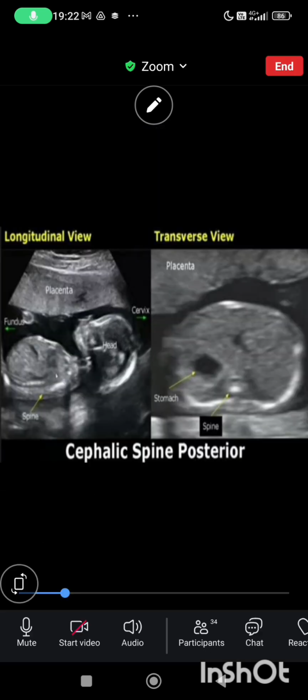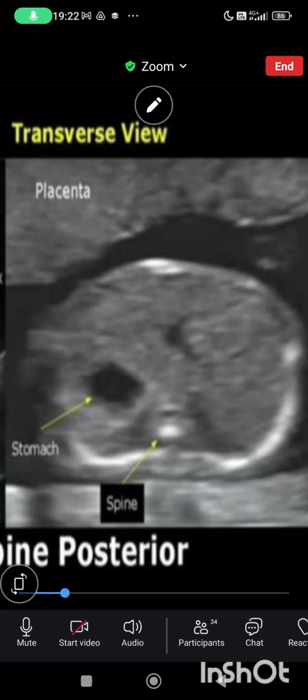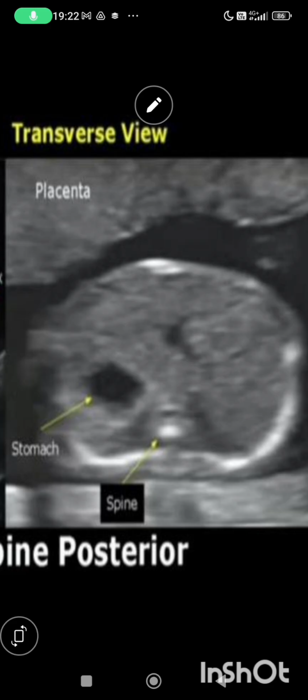So from an exam point of view, they give you this type of picture. What is the purpose? They want to test how you apply normal situs identification and situs inversus in clinical practice. If it is a cephalic fetus, and the spine and stomach match in a clockwise direction, you know it is a normal presentation.